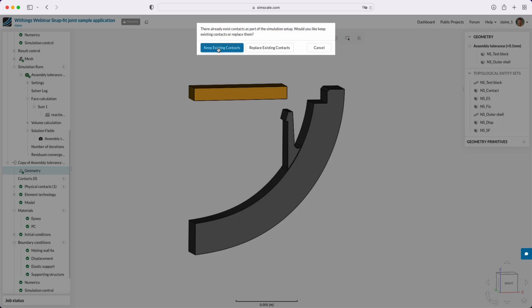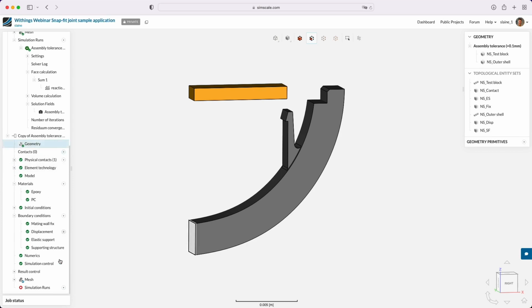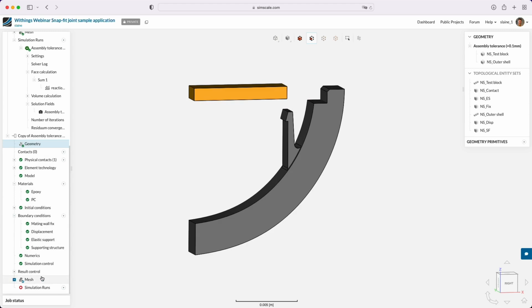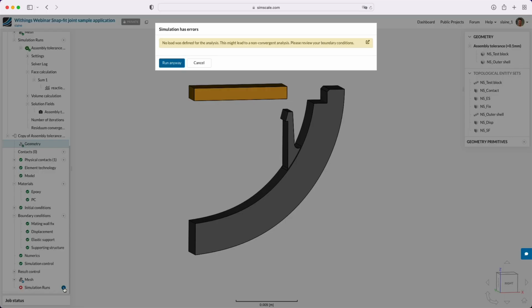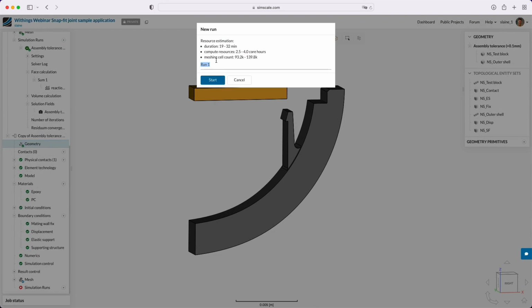So SimScale sees that we've got some contacts, say that we want to keep those same contacts, and we've got associativity between the geometries. So all our material assignments, etc., are preserved. So in a matter of seconds there, I've imported a new geometry for a different simulation, and we can immediately start that simulation running. I get a warning that I've got no load defined here. That's fine because I've defined a displacement. So we can start that new run off now.